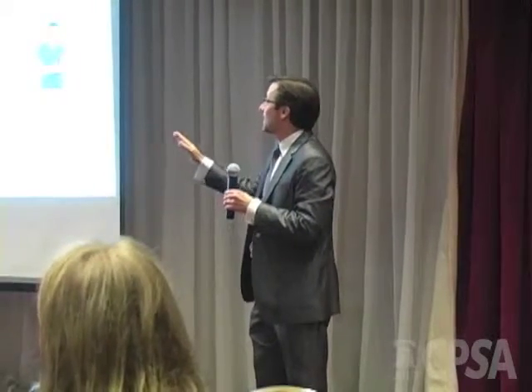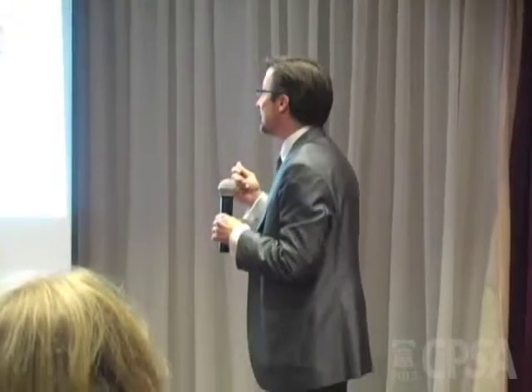We need fidelity in our analysis from the patient through to the analytical result. If a physician is going to make an informed decision, they need to know that the data is good. So if we look at the existing and future needs for clinical mass spectrometry, we can go back to Fred McLafferty's 4 S's. We need speed, sensitivity, selectivity, and the 4th S being the dollar sign. We need low cost. So what was true 30 years ago in mass spectrometry is true today.